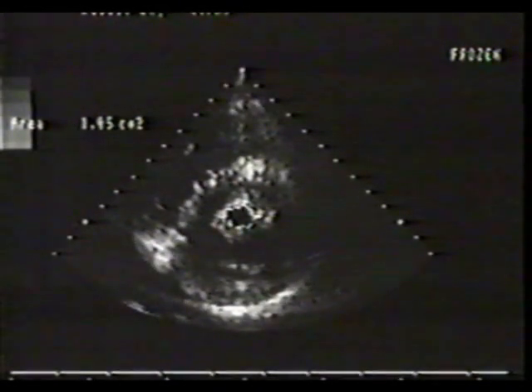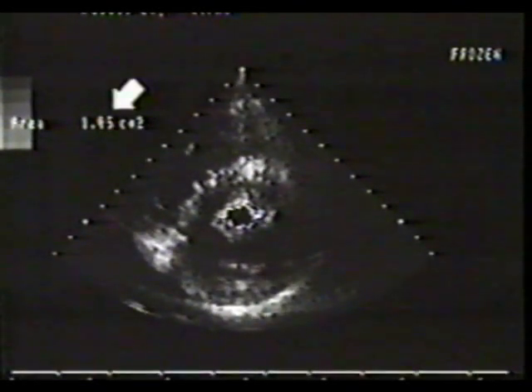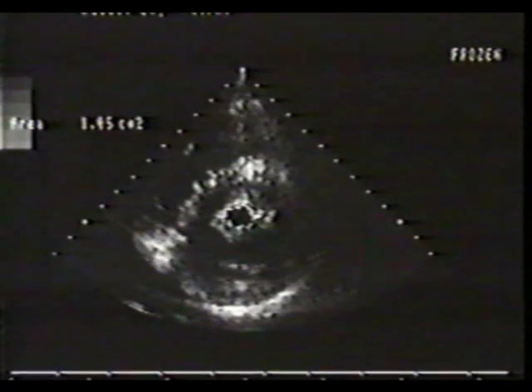In this same patient, the short-axis 2D view was used for a direct tracing of the mitral orifice. The area so obtained, 1.05 centimeters squared, agrees closely with the Doppler-derived valve area. Whenever possible, the 2D and Doppler methods should both be used to calculate the valve area. Using one as a check against the other will increase your confidence in the result.